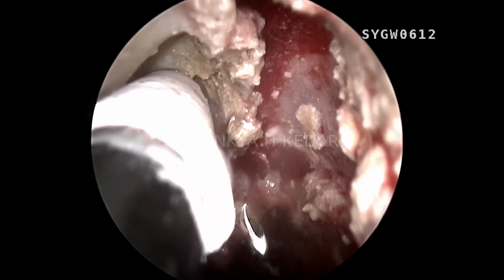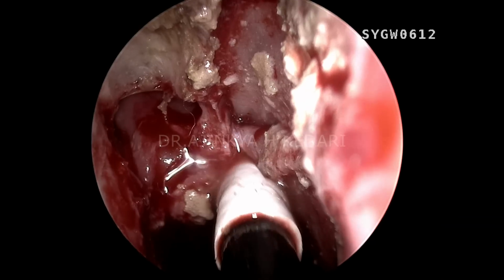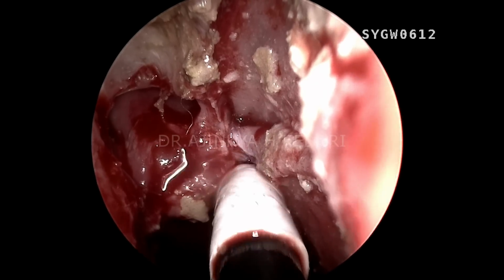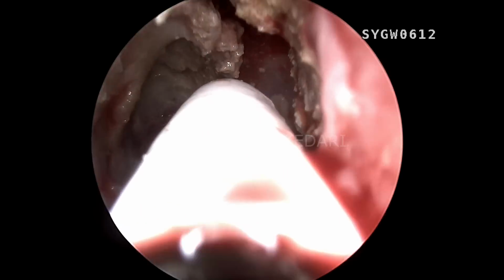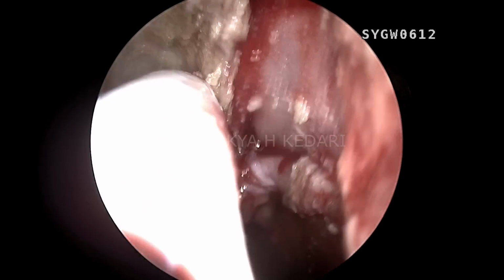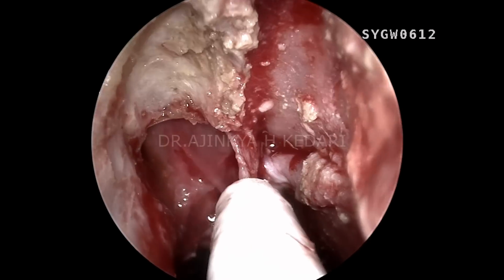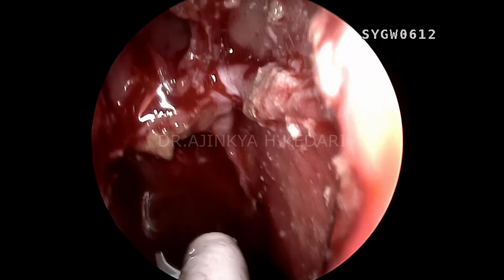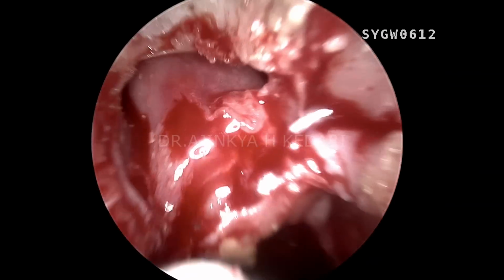So you can now see that is the area of the anterior inferior frontal beak, and now it's the area of the cribriform plate down there where my suction is right now. So always keep the first olfactory neuron in your sight, and anything that is anterior, you can drill very easily. What you can see on the screen where my suction is is all the frontal beak. Once we remove that, we'll be having a head-on approach directly on the patient's posterior sinus wall.